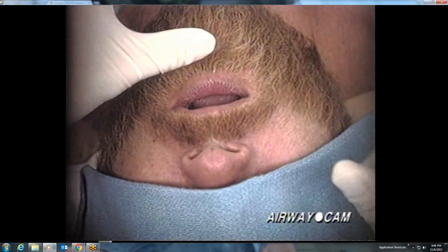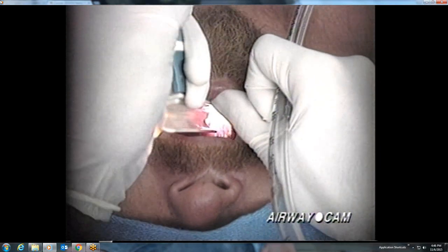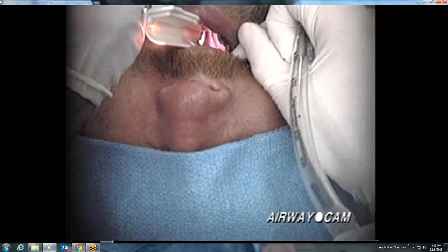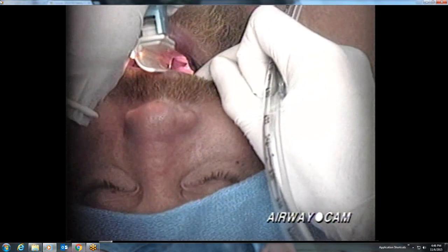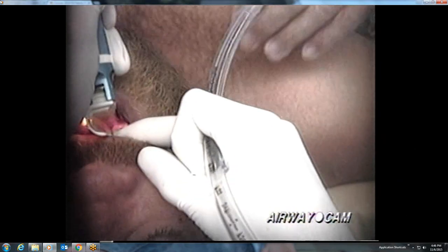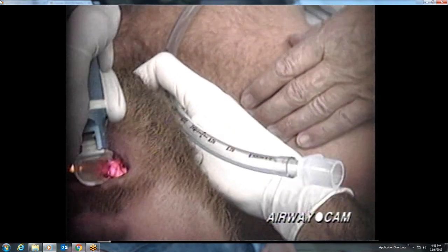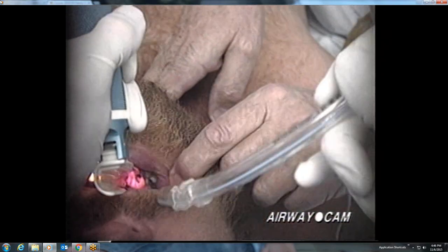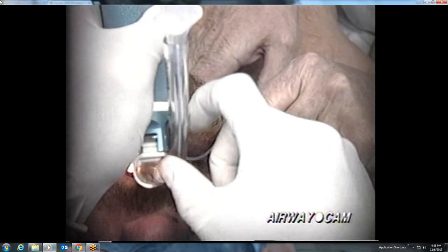This next intubation with a Miller blade shows the posterior pharynx, epiglottis, and esophagus as the blade is advanced, withdrawn, and re-advanced in an effort to directly elevate the epiglottis. Unlike the curved blade, the straight blade has no stability along the curvature of the tongue and no natural stopping point since it is not positioned into the vallecula. The laryngoscopist reaches around to the anterior neck with his right hand to posteriorly displace the larynx, bringing it into better alignment with his line of sight. Retraction of the upper right lip aids visualization as the tube is passed.